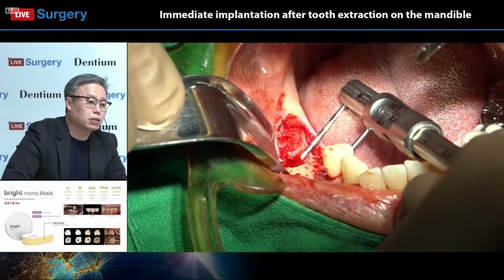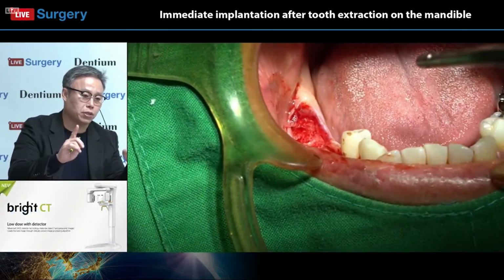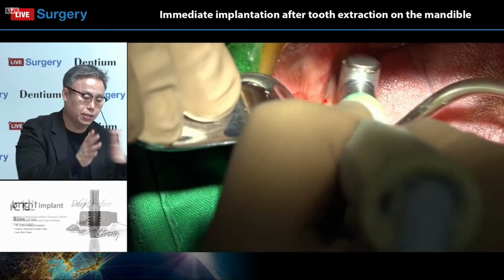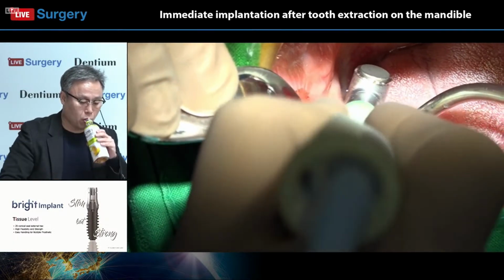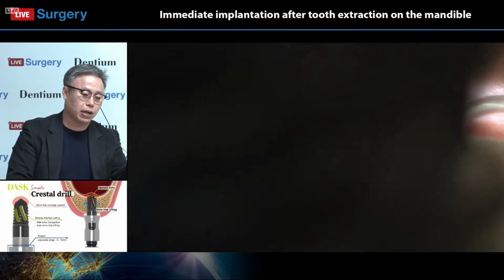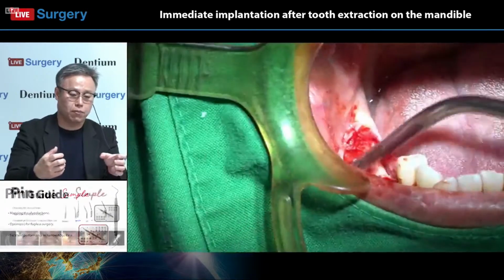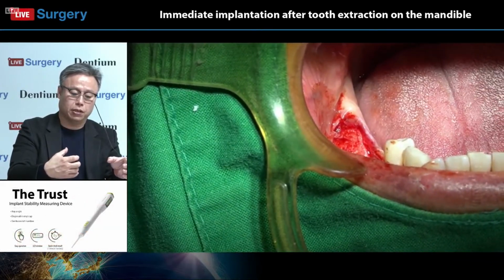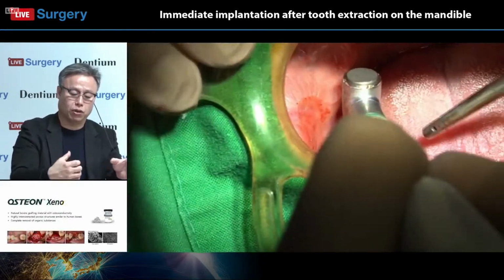And he's measuring with, I think, a caliper, the instrument measuring the distance between two bony site preparation points. As we all know, after placing implants, we need enough distance between two implants. The recommended distance is 3 millimeters. Therefore, let's say we are placing two adjacent 4 millimeter diameter implants, we need 3 millimeters between the implants. So the distance between drilling points is 7 millimeters: 2 millimeters on this side, 2 millimeters on the other side, and 3 millimeters between the two implants.